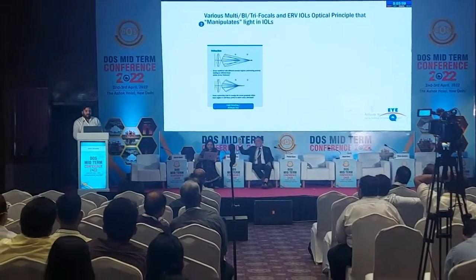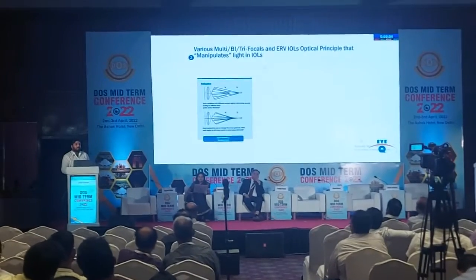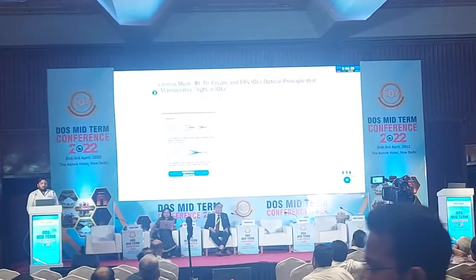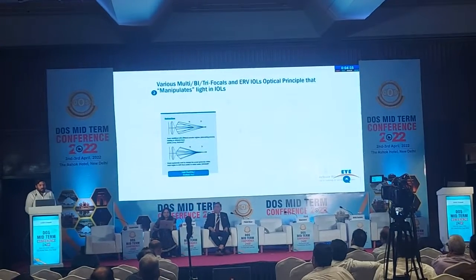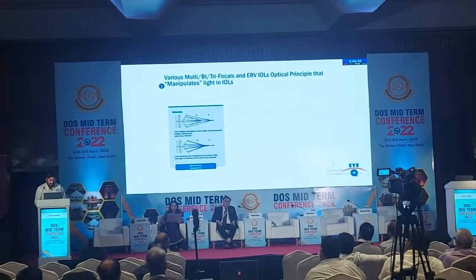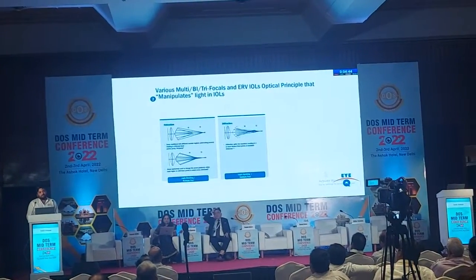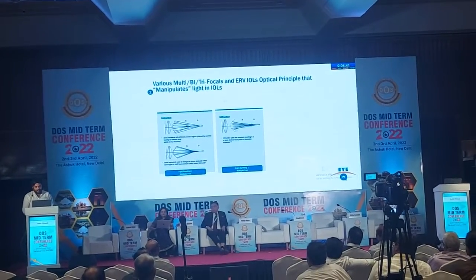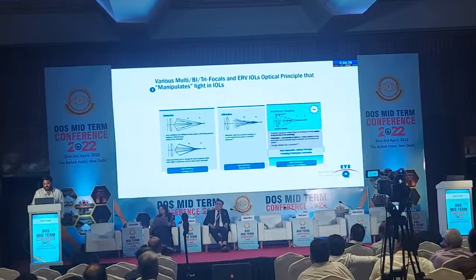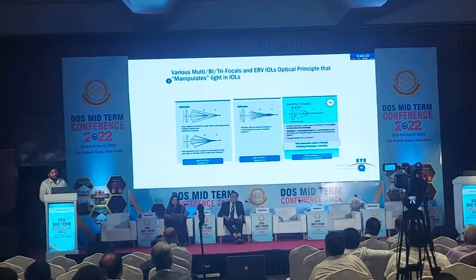So there are various kinds of multifocal. Now these days we further classify multifocals into bifocal, trifocal, extended depth of focus based on the optical principle. Firstly, it would be based on refractive mode, where it will have zonal multifocal with different annular lengths creating different focal points, or it could be diffractive like the majority of our multifocals, the trifocals, Panoptics, and the most recent EDOF, which is the wavefront shaping. Sir has already covered it in his presentation.